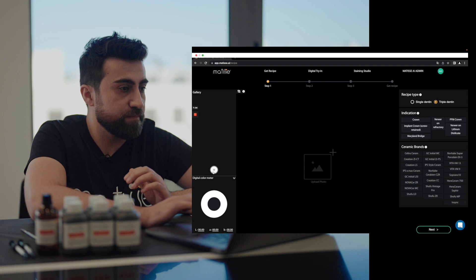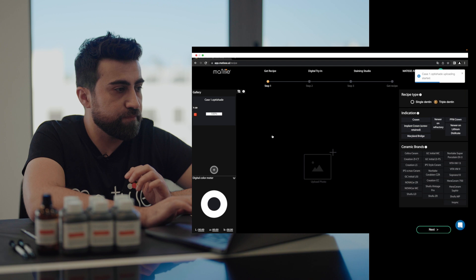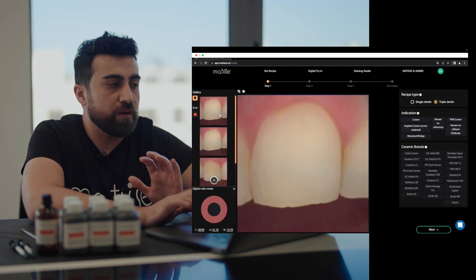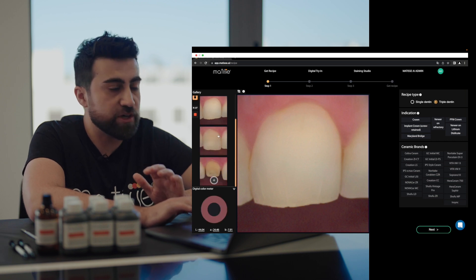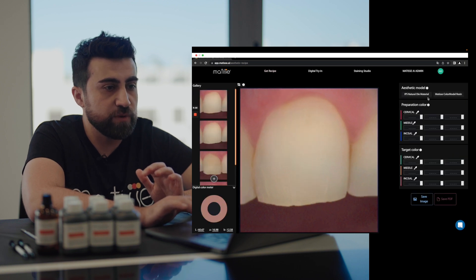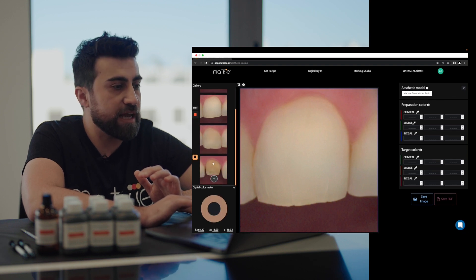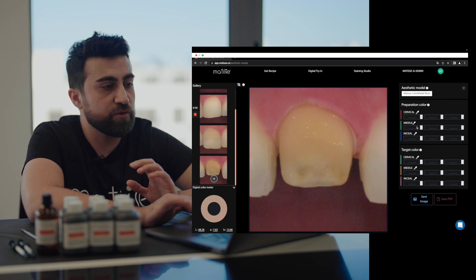First, we need to receive a recipe from Matisse software. We upload OptiShade images — you will need a picture of the target tooth and the preparation color. Once the pictures are uploaded, we go to aesthetic model, select Matisse color model resin, then select the preparation color. You have three color pickers here to generate the recipe.